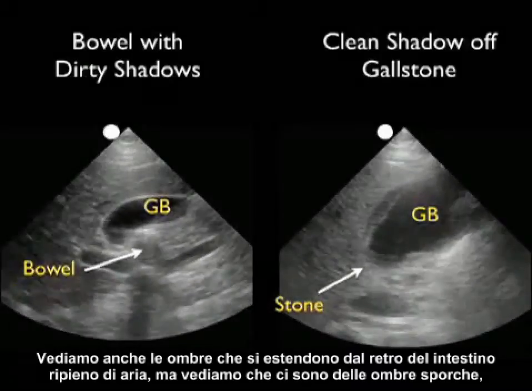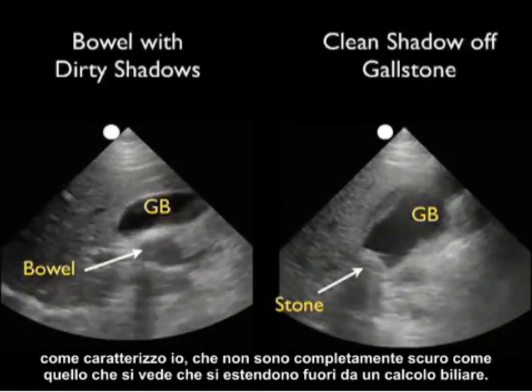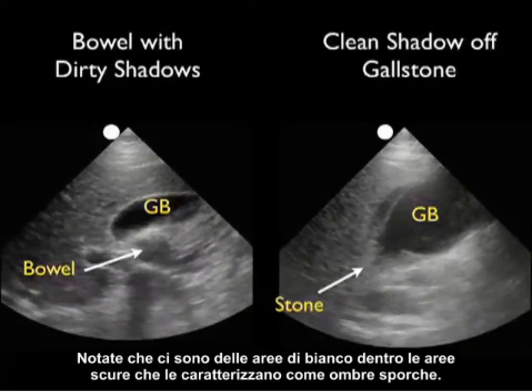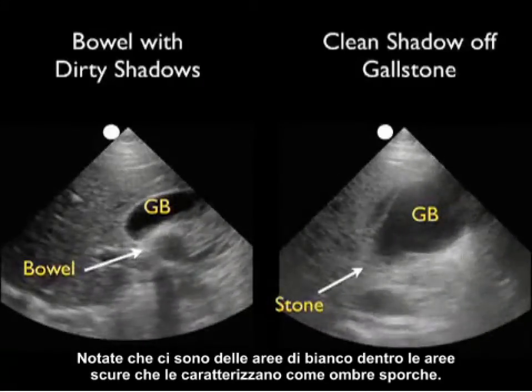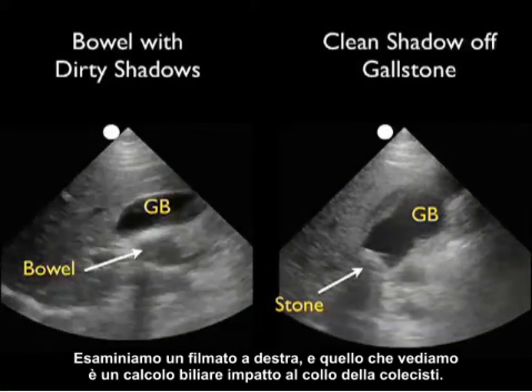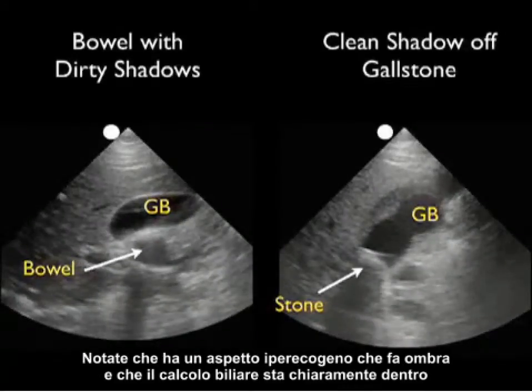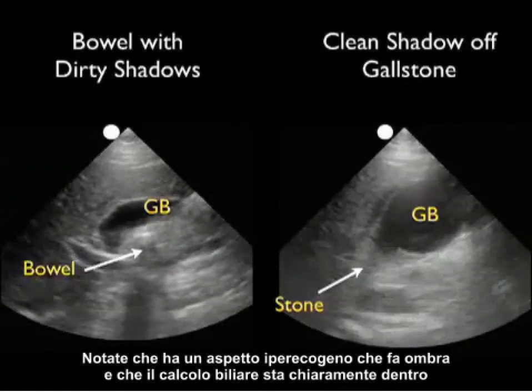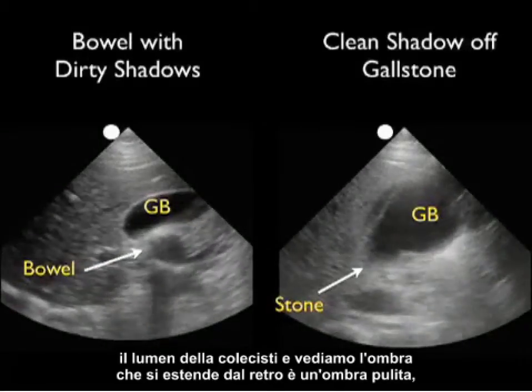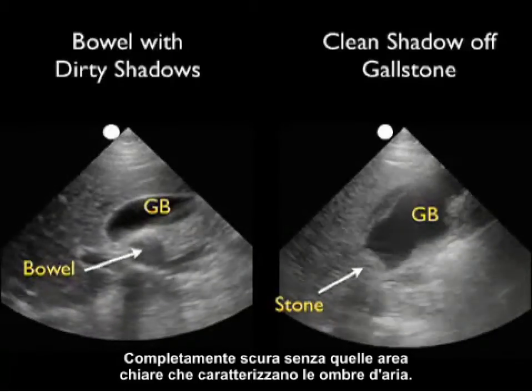Looking at the shadows off the air-filled bowel, we see dirty shadows — not completely dark as those seen off a gallstone — with areas of white within the dark regions characterizing a dirty shadow. In the right video clip, we see an impacted gallstone at the neck of the gallbladder with a hyperechoic appearance clearly within the lumen. The shadow coming off the back is a clean shadow, completely dark, without the light areas that characterize air shadows.